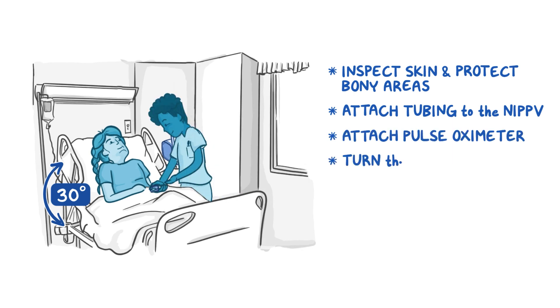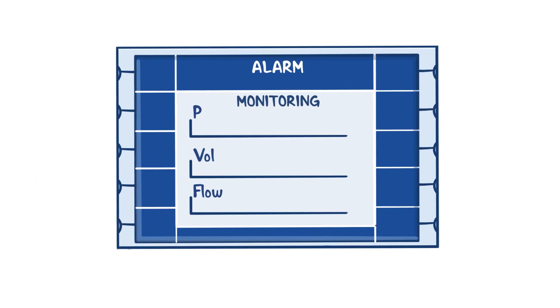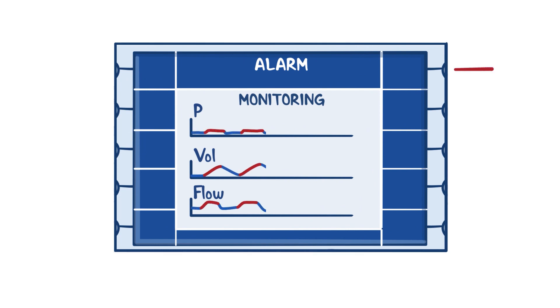Now turn the NIPPV on and set the machine settings at the lowest level of support. Normal physiological positive end expiratory pressure, or PEEP, is around 5 centimeters of H2O, and so we should initially set our CPAP to something similar, like 4 to 8 centimeters of H2O. In our example, let's start with a CPAP of 5 centimeters of H2O.